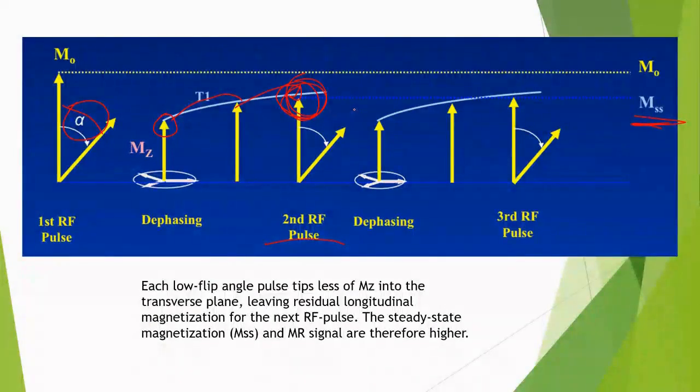So, you see, you have made a difference between the new area that has entered and the existing tissues, right? The new area that has entered will be captured in the imaging. Why? Because it won't escape. Why won't it escape? Because your sequence is short.